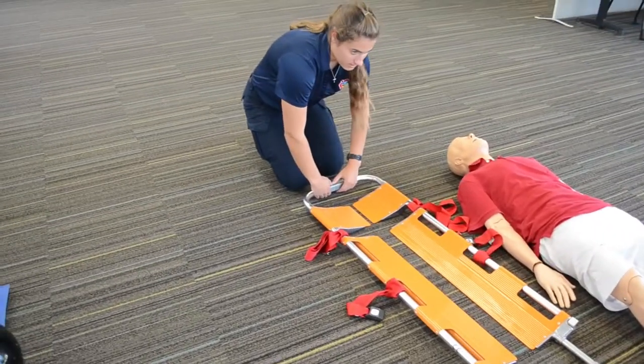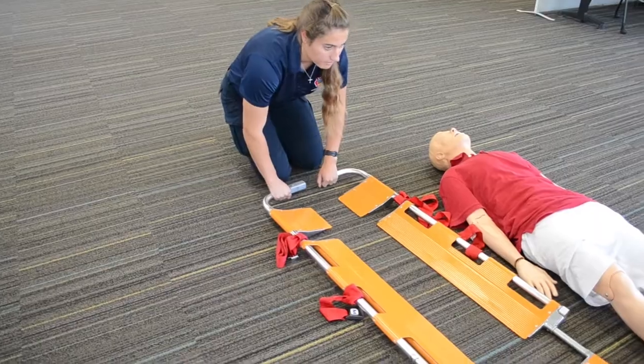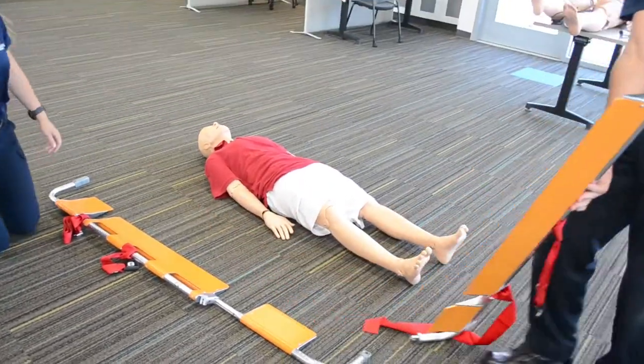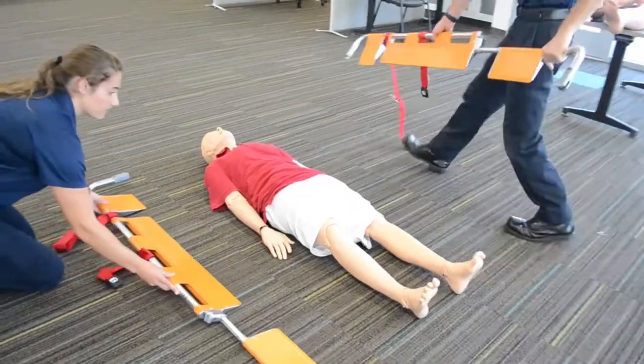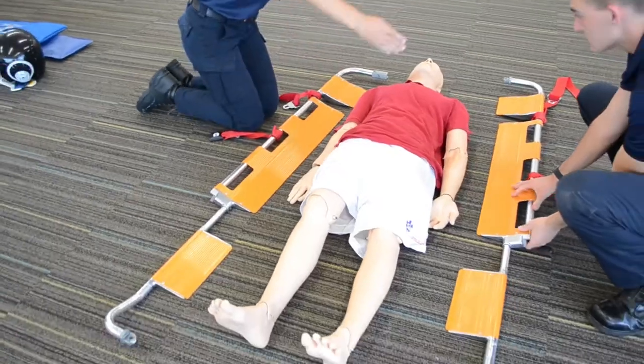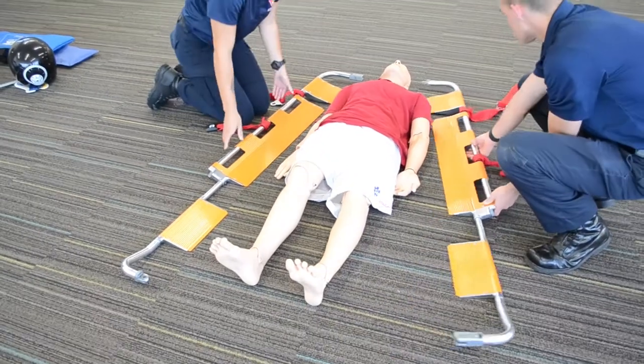We're going to detach the sides and I'm gonna have my partner go around to the other side of the patient. Never pass anything over the patient. We're gonna make sure we're aligned before we even try to get the patient on it.